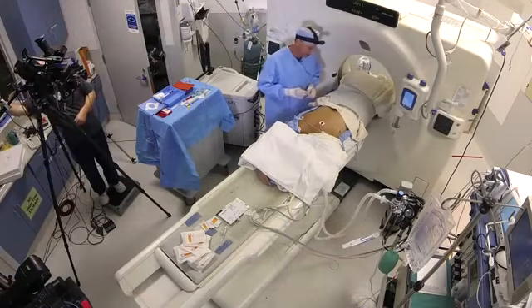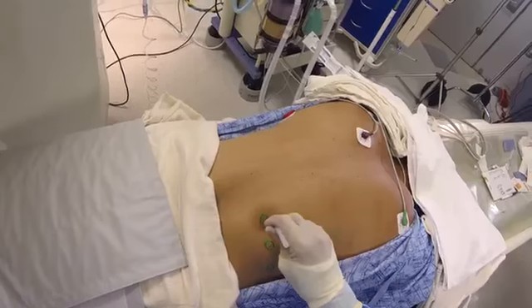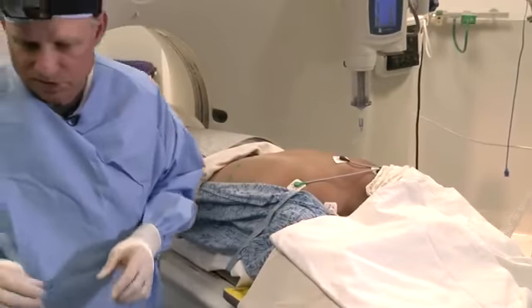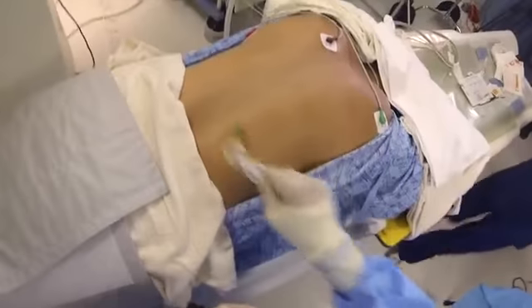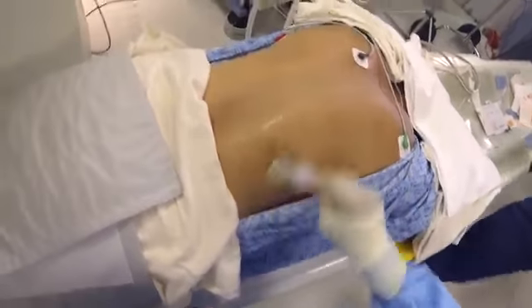So we're back at the patient's side here. These are the fiducials that we've put down to mark our level. I've determined that this is the path we'll take. So we'll go ahead and clean him up. Michelle, can you pop these BBs off? Thanks.